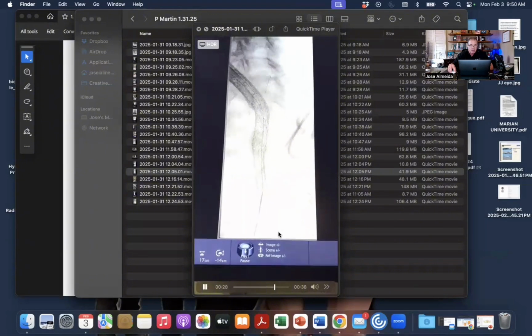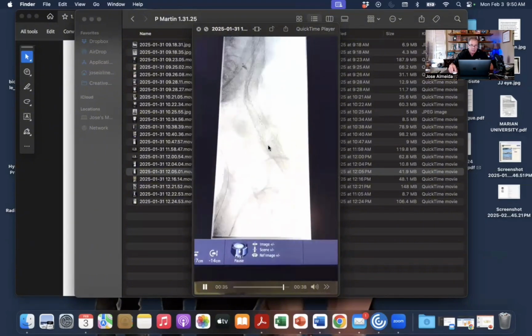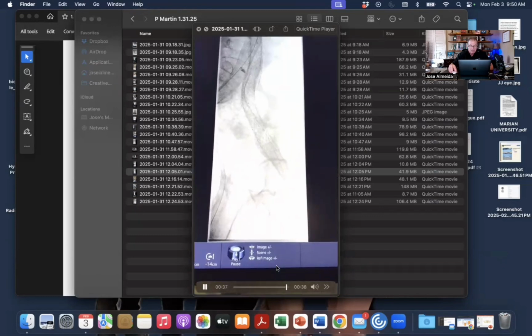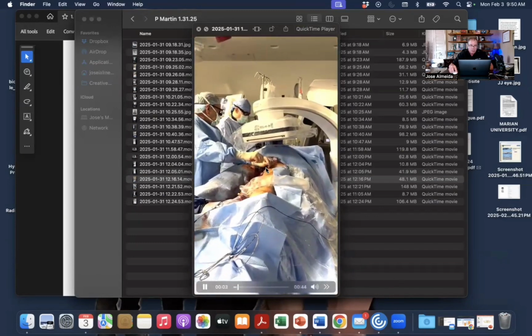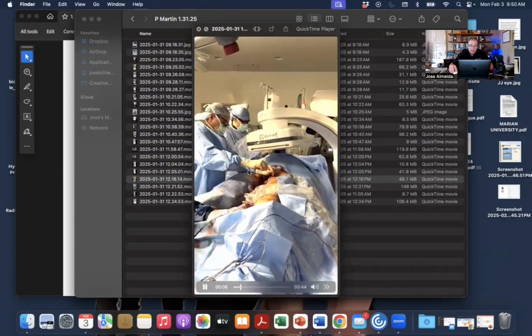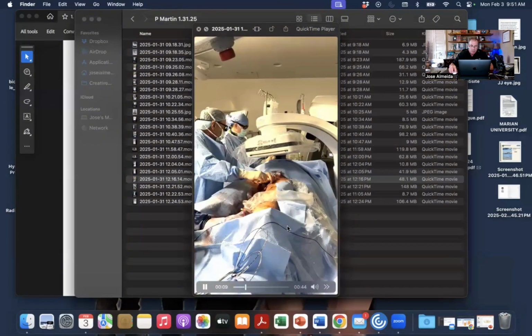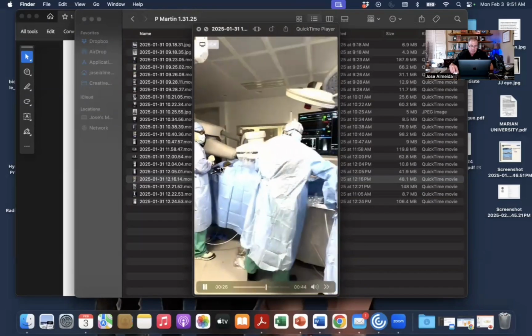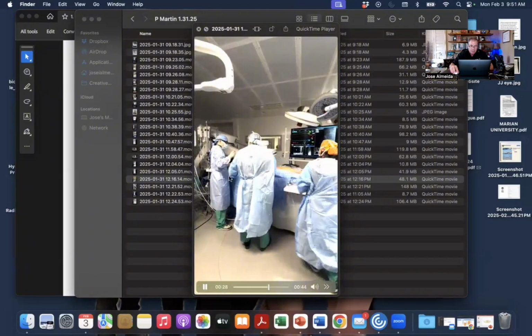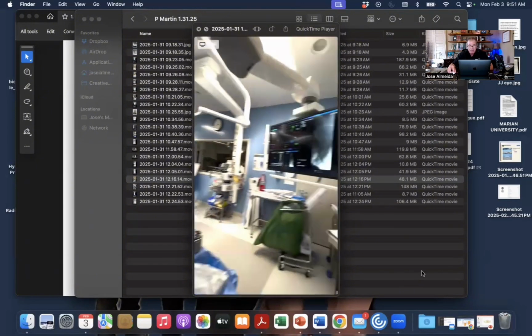These wires are great for crossing occluded stents. Here we use oblique views to ensure that the wire is inside of the stent. Of course, you can confirm that with IVUS. So we're happy with that. Now we just want to get through-and-through access with our wire. So from below, we're going to feed this all the way up through the funnel to the jugular vein and retrieve it up top. So now that we have through-and-through access with the wire, you see the wire up here, which makes things easier for tracking devices up and down like the ReCore.